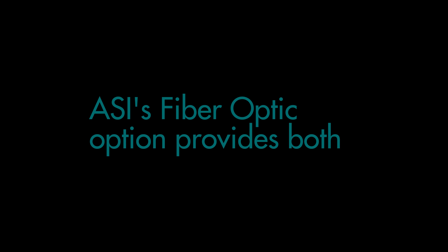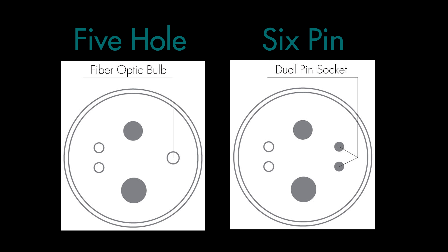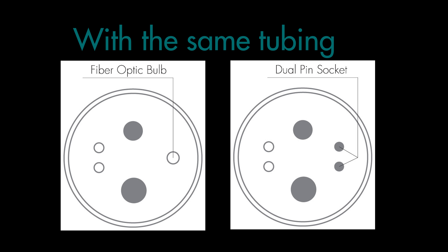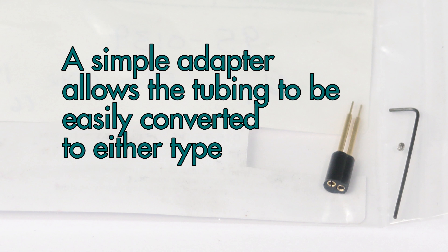ASI's fiber optic option provides both 5-hole and 6-pin capability with the same tubing so the practice can use either type of handpieces without converting the tubing. A simple adapter allows the tubing to be easily converted for either type.